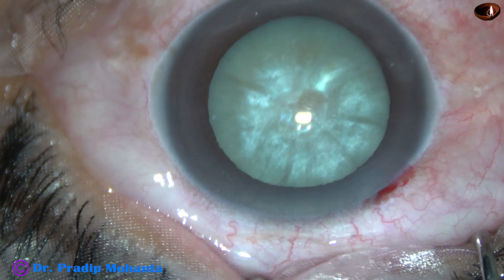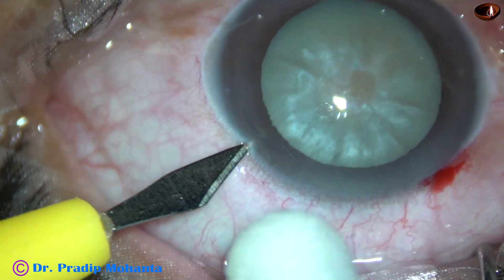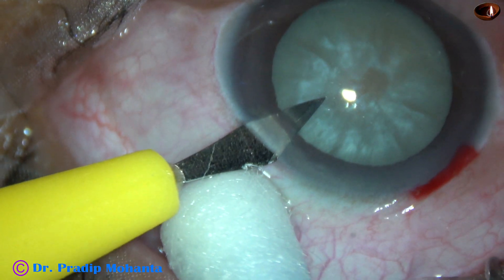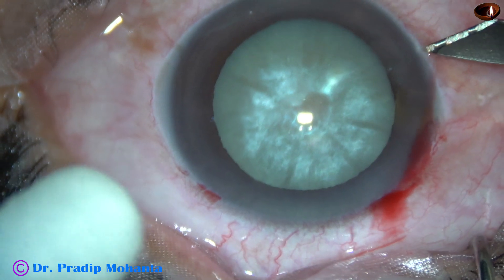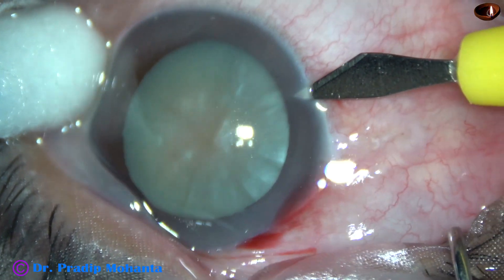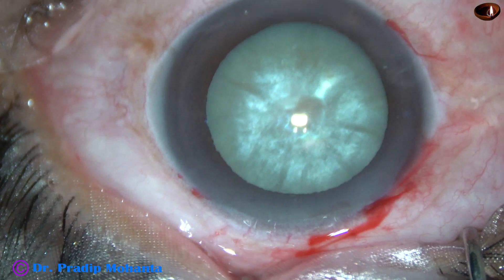And now two side ports are made — one on the left side, the other one on the right side. The side ports are about 3 clock hours away from the main incision.